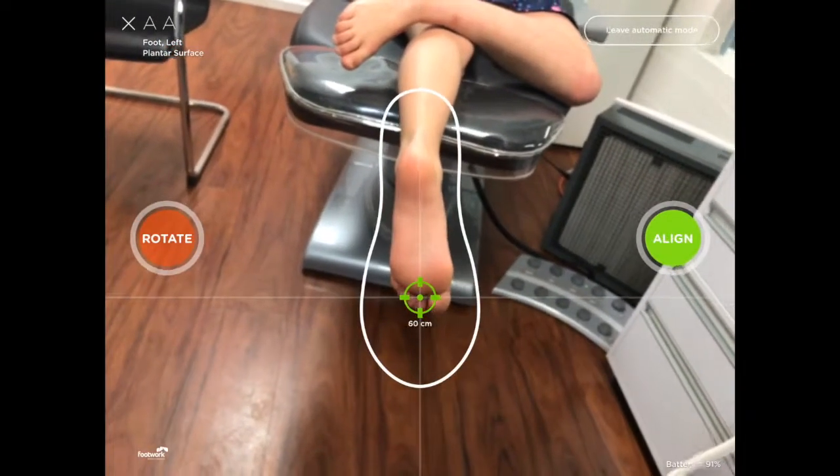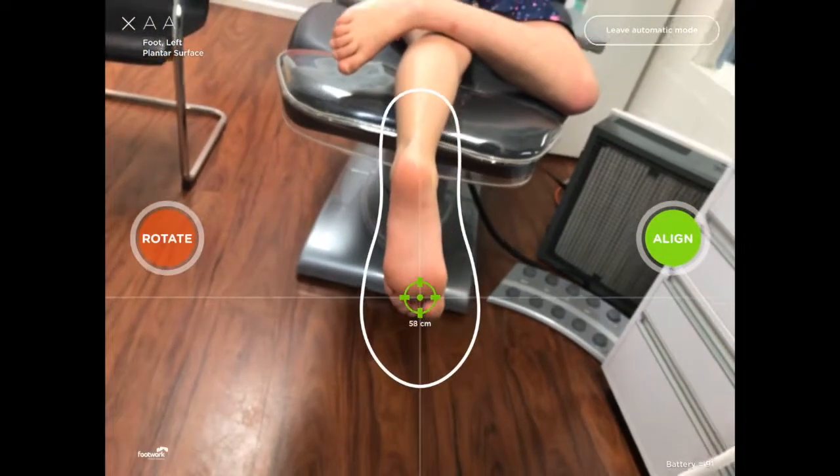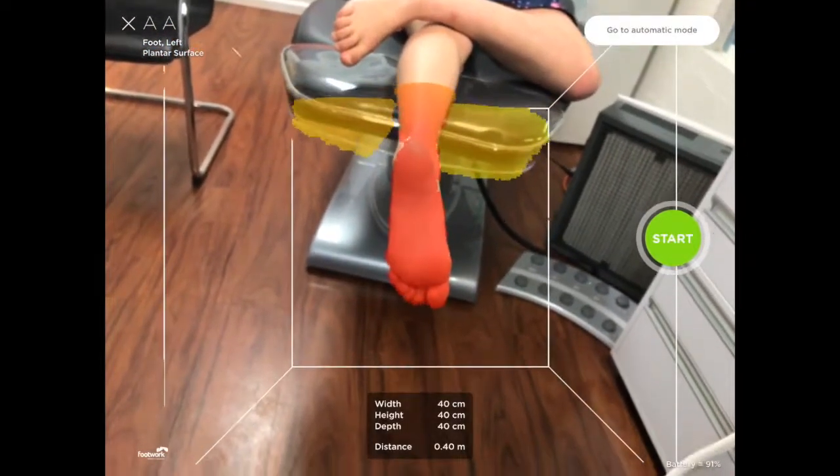Really simple and very useful. If you haven't got a Structure Sensor 3D iPad scanner, you're really missing out on an amazing piece of technology in your practice.